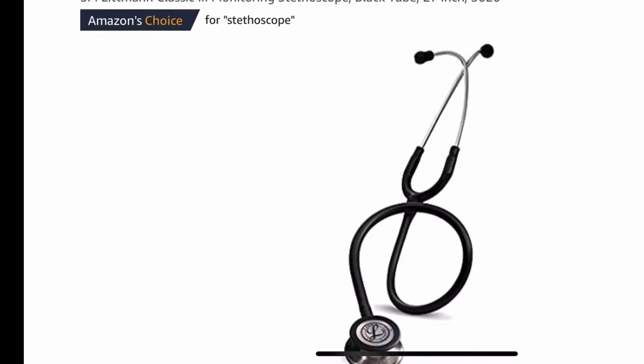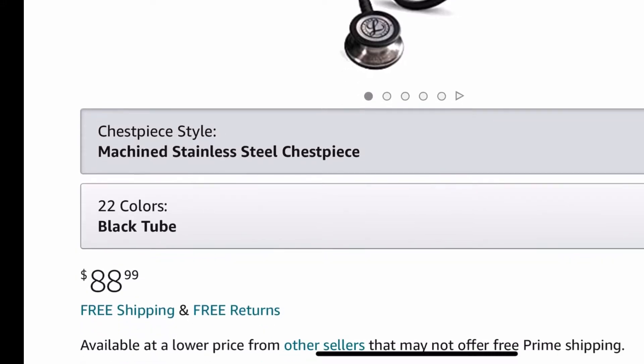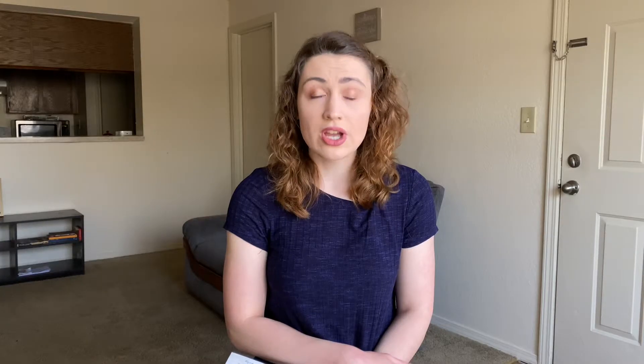So currently on Amazon the Classic III is going for about $89, and that's for the color black — different colors can be more expensive. So let's see what you get for the price.